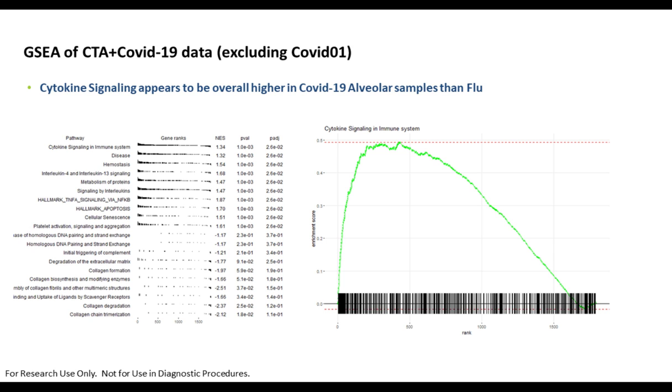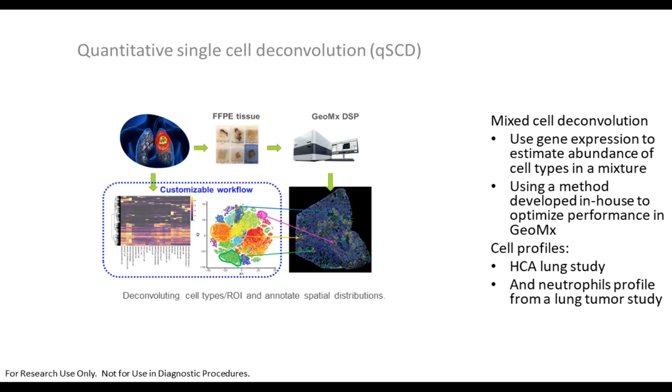And this is denoted here with essentially the signaling pathways that are upregulated. You can see here, just on top, that the cytokine signaling is markedly upregulated, which is something that Chris had already pointed out earlier, a variety of interleukin signaling, TNF signaling, and others. And this is all consistent with what we're seeing clinically as well as histologically in these samples. So it's really capturing that quite well. And as we drill more deeply into this over time, we're hoping to be able to better understand the biology that is going on here.